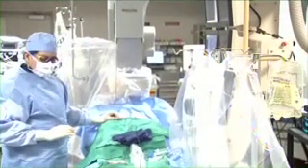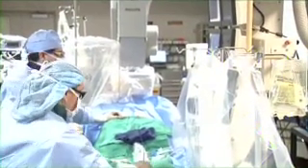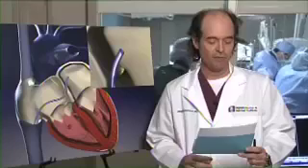Okay, so we leave it up for a little bit here, and we're going to go and now place the delivery sheath across the atrium. Ramon, while you're doing the delivery sheath, I want them to stay on you and watch. Go ahead.